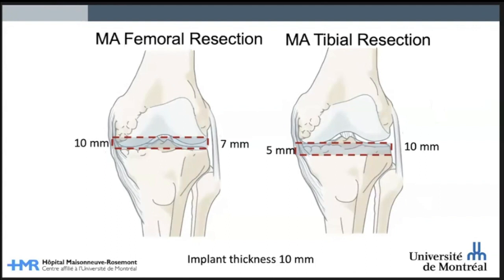Okay, so let's see what we do during the normal mechanical alignment surgery to the joint space and gaps. First, you can see on this screen, when we apply the distal cutting jig on the distal femur, mainly the jig touches the medial condyle first because of the valgus alignment of the distal femur. So we resect about 10 millimeter medially and a bit less laterally, 5 to 7 millimeter. So we distalize the joint line on the lateral compartment.